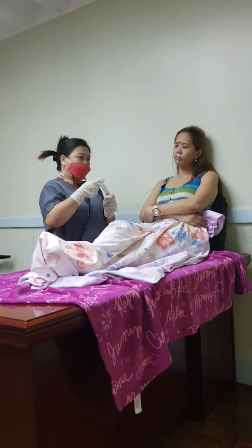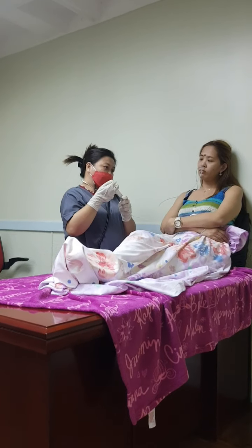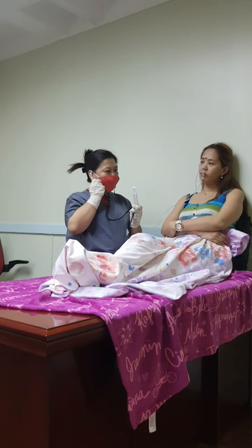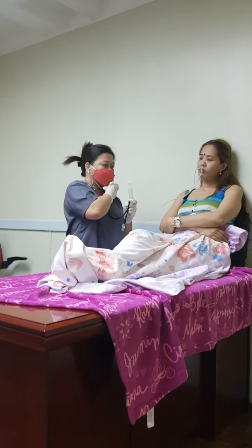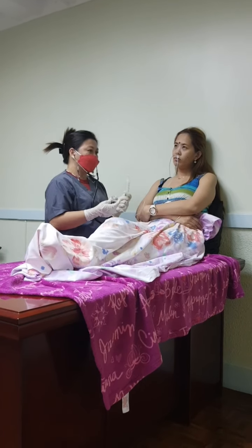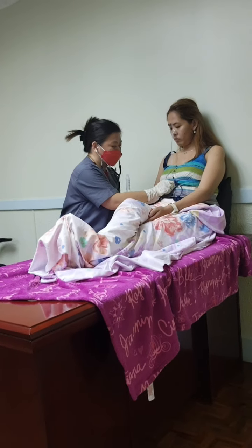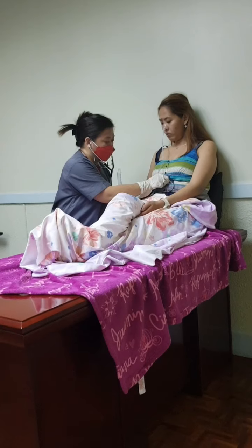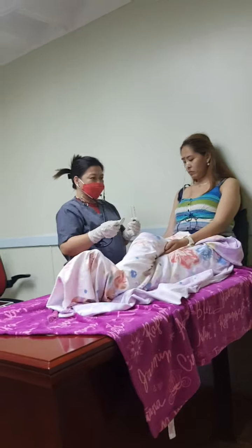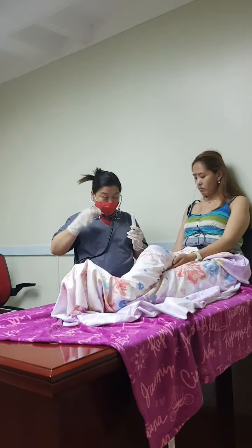Auscultation. Inject a small amount of air, 10 to 15 ml, into the nasogastric tube while listening with a stethoscope approximately 3 inches, about 8 cm, below the sternum. Obtain a radiograph of placement of the tube as ordered by the doctor.